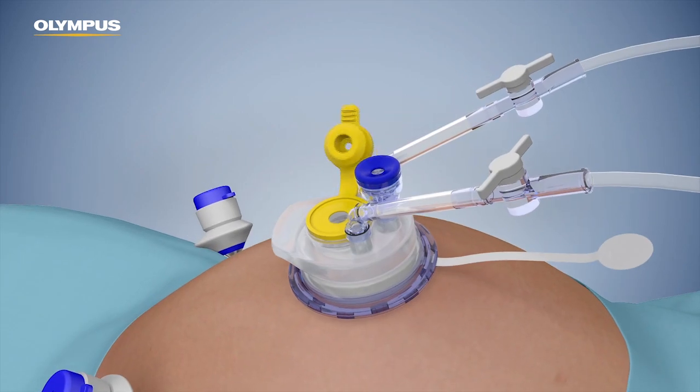When using the reducer, a 5-millimeter instrument can be inserted through the yellow valve. Insert a 5-millimeter laparoscope through the 5-millimeter instrument valve on the boot or through a separate 5-millimeter cannula.